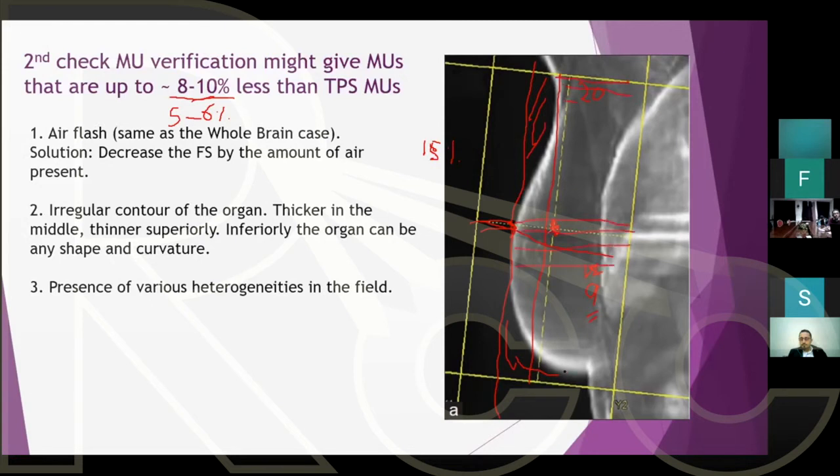And then it goes into this weird shape where you have the breast fold. And not just from this beam's eye view. Remember, the breast can move in any direction, so the shape in 3D is different. Your planning system knows this, but your Excel sheet doesn't know that.